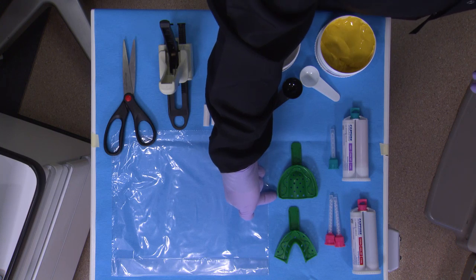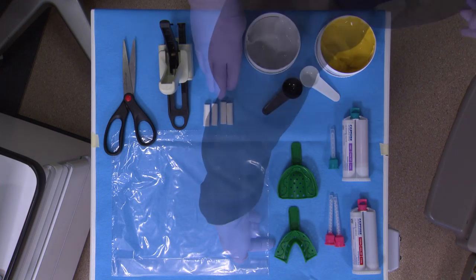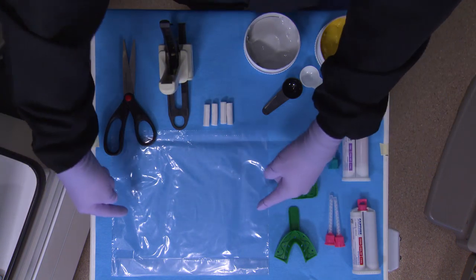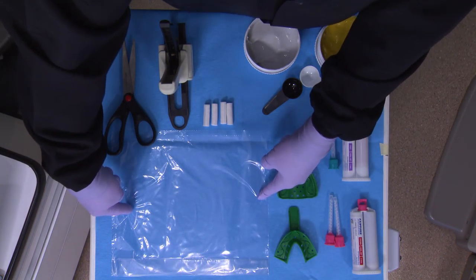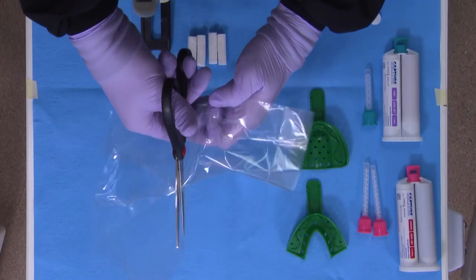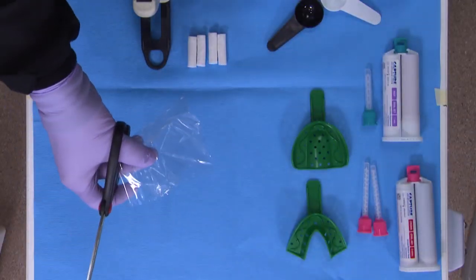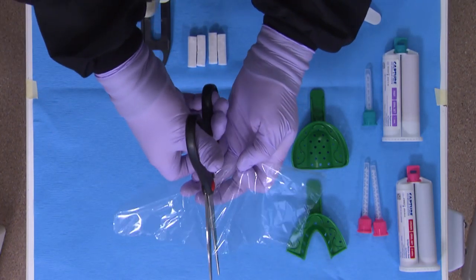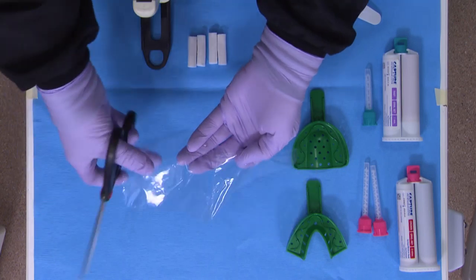You're going to use a full arch maxillary and mandibular impression tray. Get four cotton rolls and a plastic headrest cover or a chair cover, along with a pretty standard pair of scissors. To get these plastic sheets ready, we're going to cut about a 4x4 inch square out of the folded cover. Open it up if you need to and cut it again through the midline, just to separate it into two 4x4 inch squares.